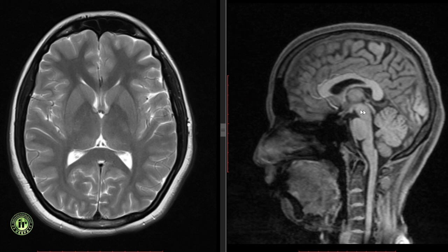The brain stem comprises of the midbrain, the pons and the medulla. The midbrain is also known as the mesencephalon, and the pons, medulla and cerebellum together constitute the rhombencephalon. Let us have a look at the midbrain.